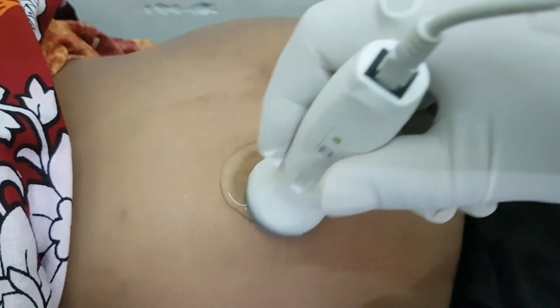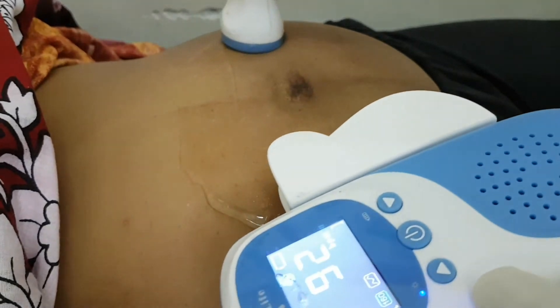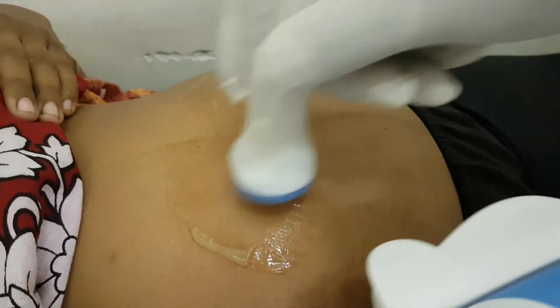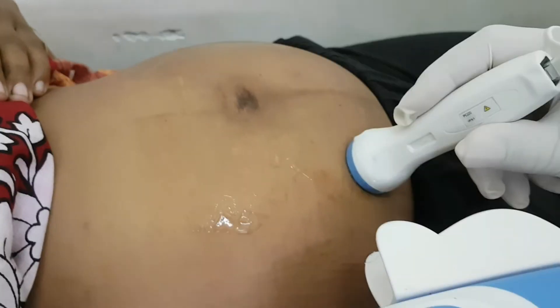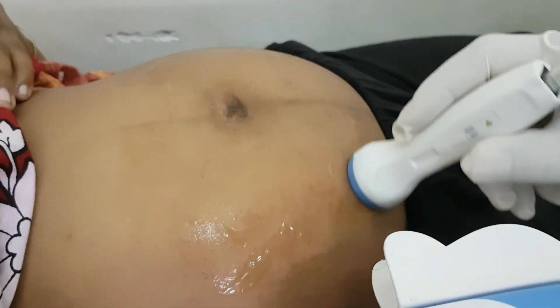I press the probe over the abdomen of the pregnant lady to search out the heartbeat. The heartbeat can be heard distinctly when the probe is at the exact location of the fetal heart.